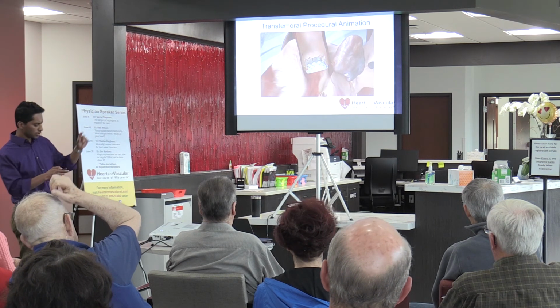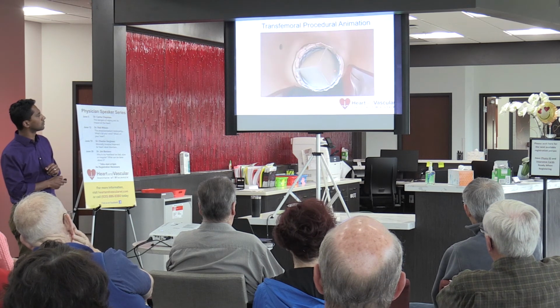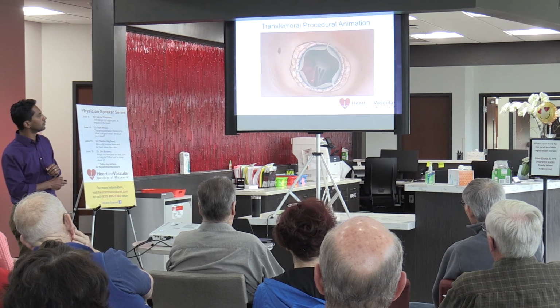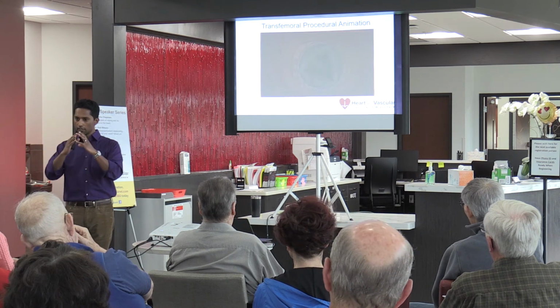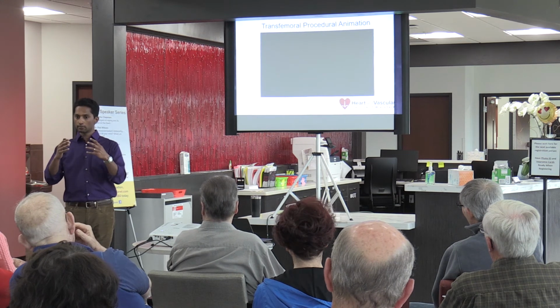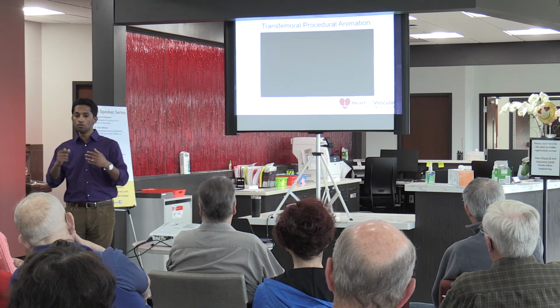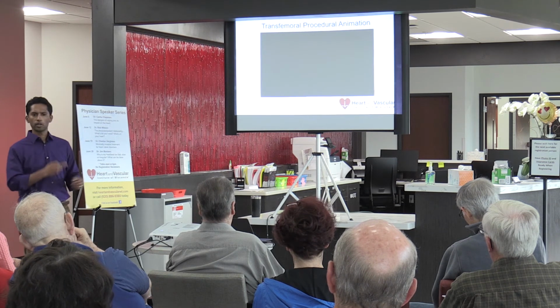They'll kind of flip it over and show you what this looks like. So essentially there's 3 leaflets, just like the traditional tri-leaflet valve. But as soon as that balloon is inflated and then deflated, as soon as that balloon comes down, the leaflets start to work right away. And you essentially have a new aortic valve. The old one has been replaced. Questions about any of that?